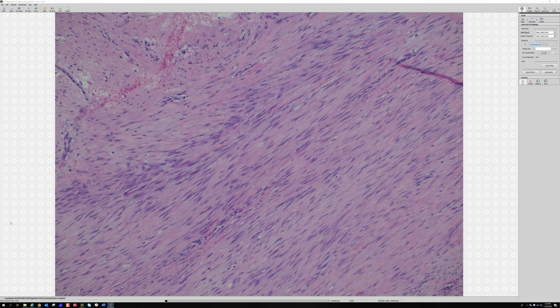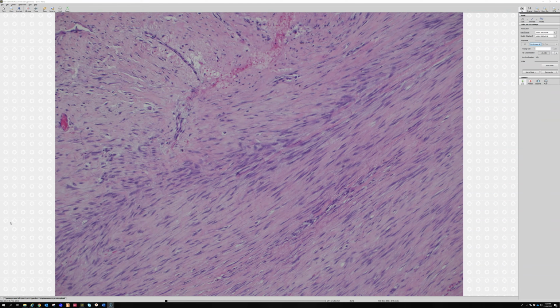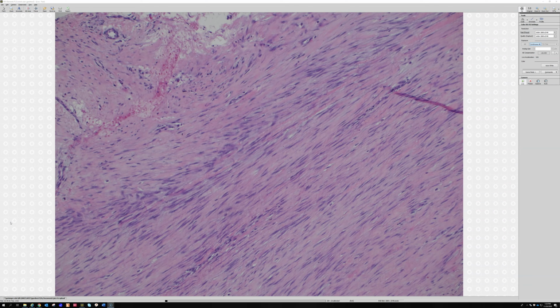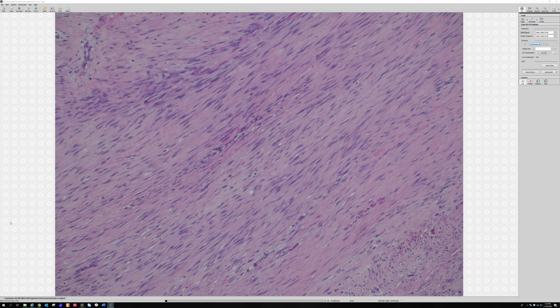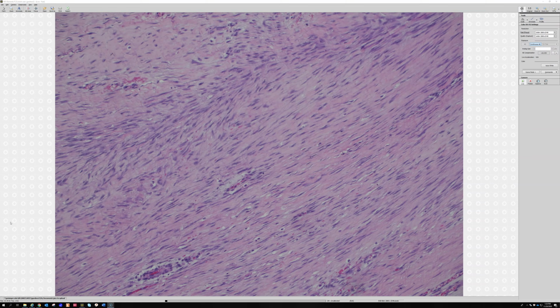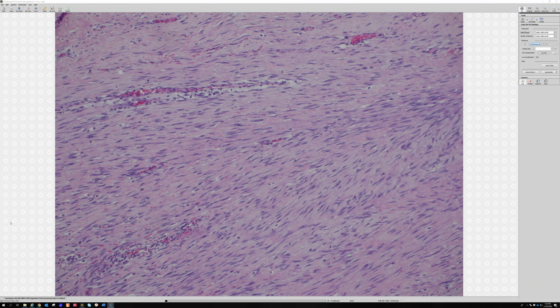Although I have seen times where it really worked, but I used to say I never use beta-catenin because it ends up causing more confusion than it's worth. But I have seen some times where it was helpful. But don't expect it to always be easy to read. I've seen some classic desmoid tumors where it was really hard to find good nuclear beta-catenin, even though it was clearly a desmoid tumor. And I've also seen times where stuff looked like it had nuclear staining, but it was actually not desmoid tumor.